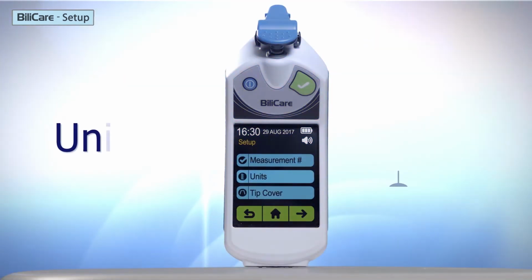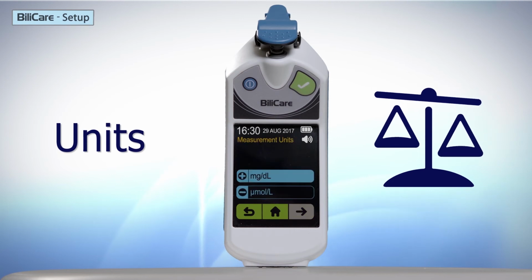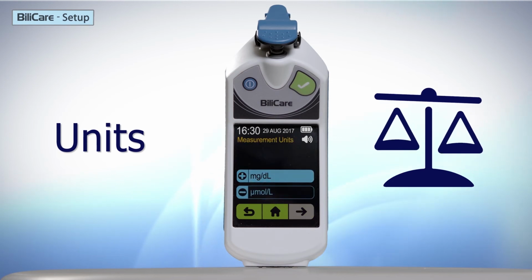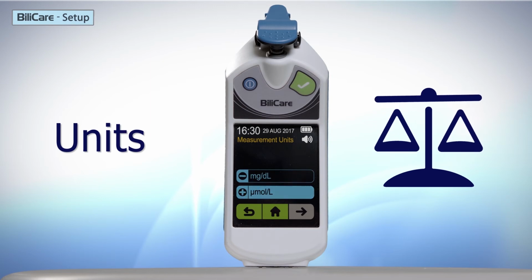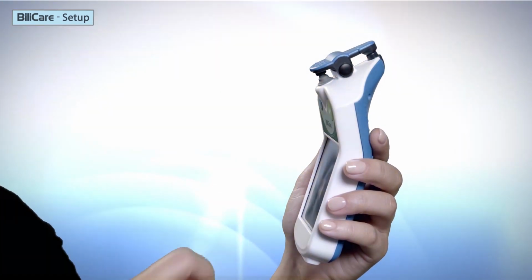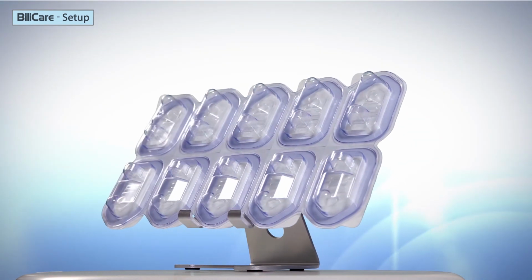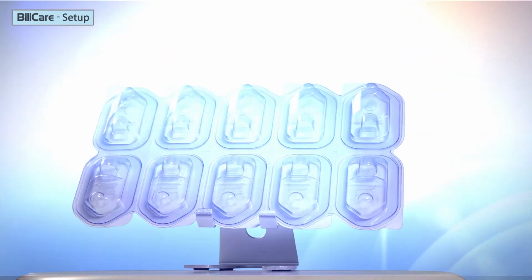The Units menu determines in which units the bilirubin result will be displayed. Milligram per deciliter is the default. Micromole per liter units may be selected. Tip cover. The tip cover menu determines whether BiliCare will be used with or without a cover on the clip.